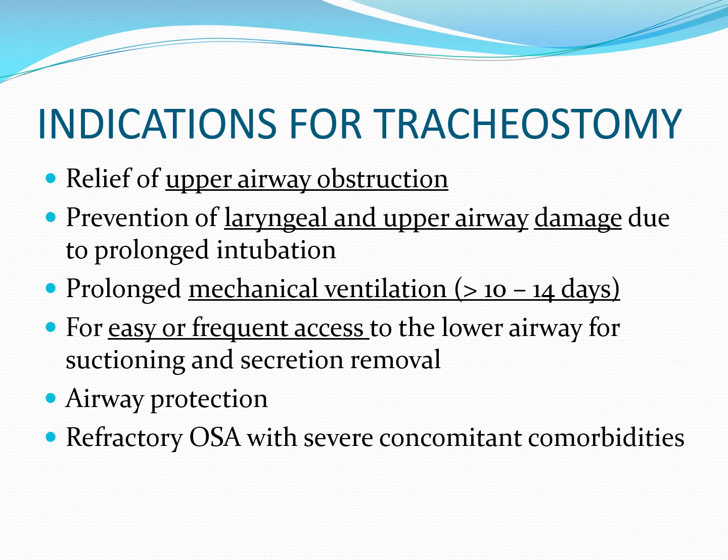Of course, unless the direction is going to be one in terms of palliative care and perhaps a one-way extubation with no reintubation. But assuming that's not the case, that tracheostomy should be done on or about 14 days or so after they've been placed on mechanical ventilation with little or no reasonable expectation that they're going to be extubated soon.